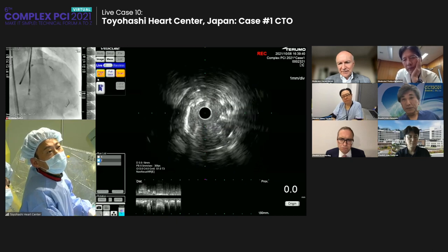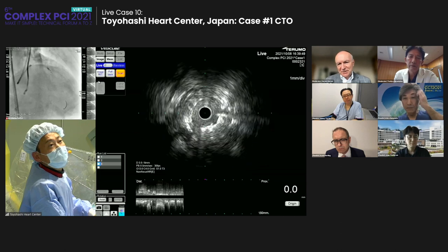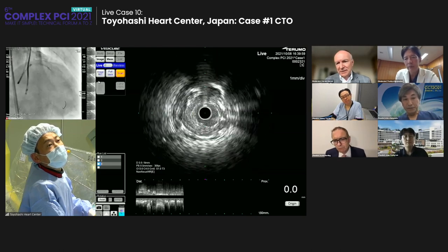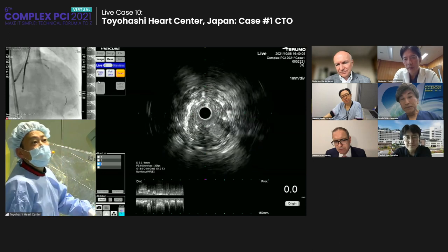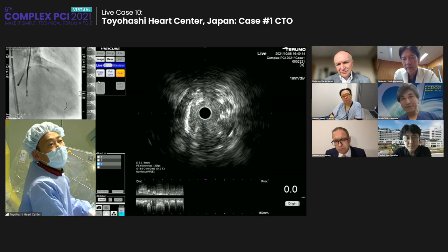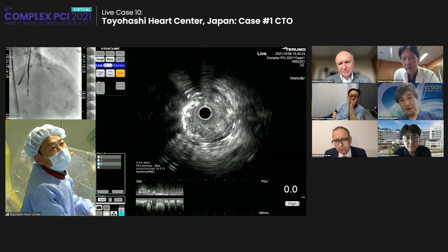But even as OCT was done, to me the stent doesn't look perfectly expanded here. I don't use OCT for the control of stent expansion. I still think IVUS gives you a better image of the depth that you can go for. Yes, I think so. In Japan also the penetration of OCT is not so high. Some operators love to use OCT for the usual practice, but I don't like it. Maybe the 3 o'clock is the diagonal, I guess. The actual orifice, we cannot be sure.